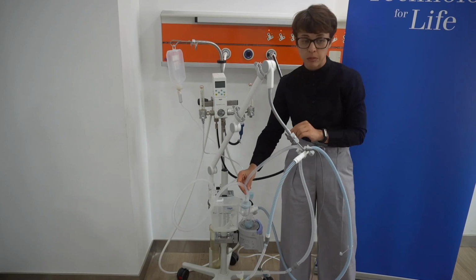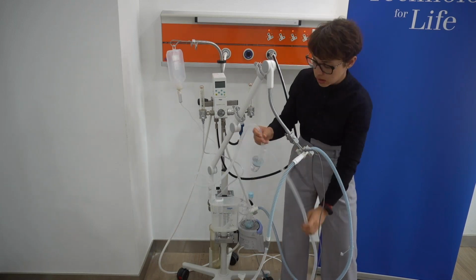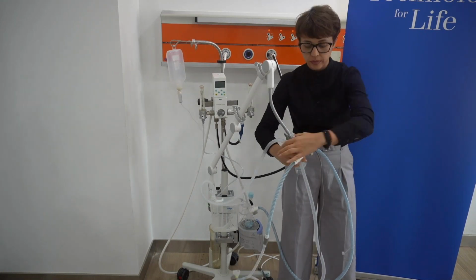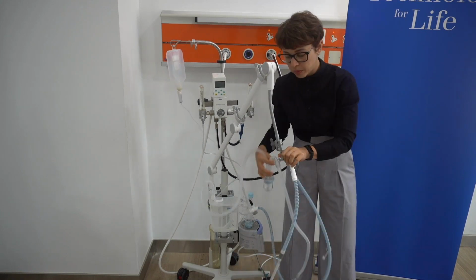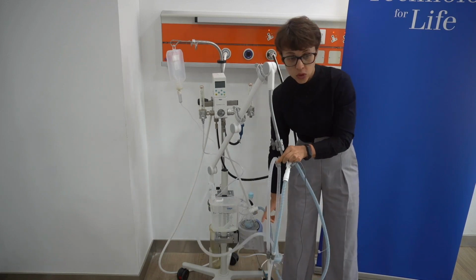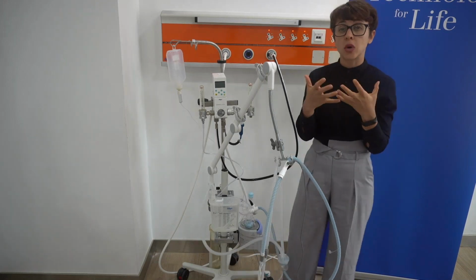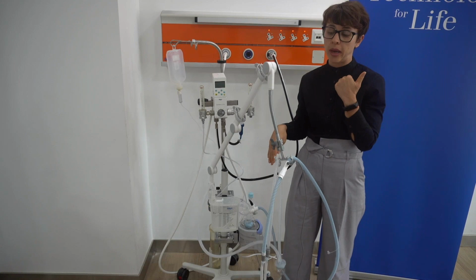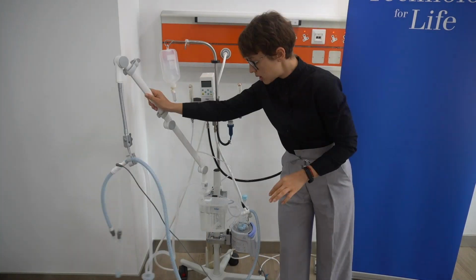And I mean vertically positioned, not in this manner, where the water trap cannot collect the liquids. So the water trap needs to be positioned vertically to the ground so that the expiratory condensation can go into the water trap and not back to the patients. So, this is with regards to the circuits.